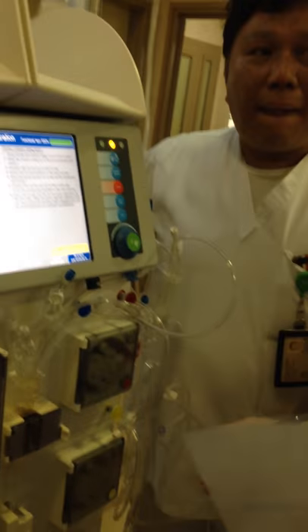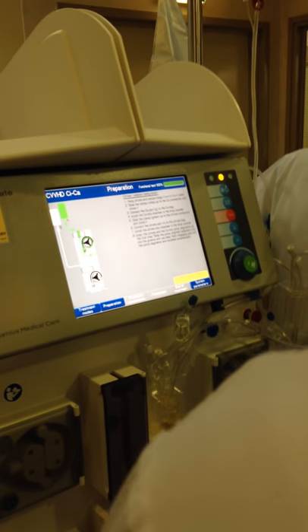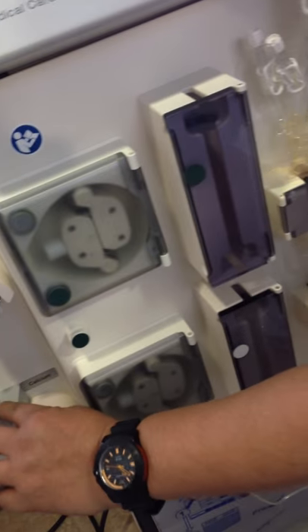All right, calcium is G. Next, install the calcium drip chamber in the drip counter. Now, calcium, all the way down. All the way down. Make sure that this is pushed, okay?